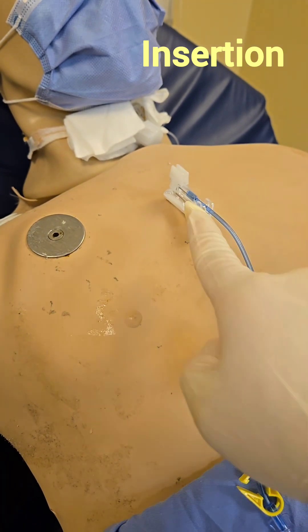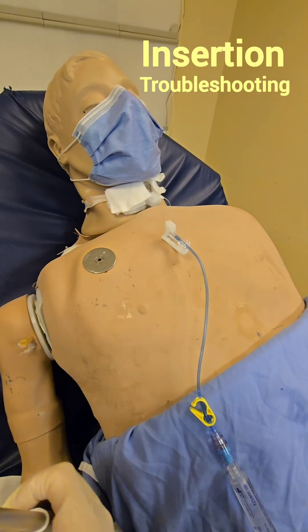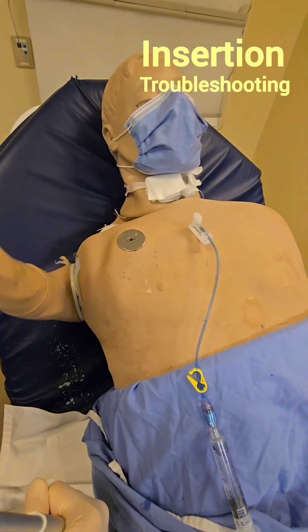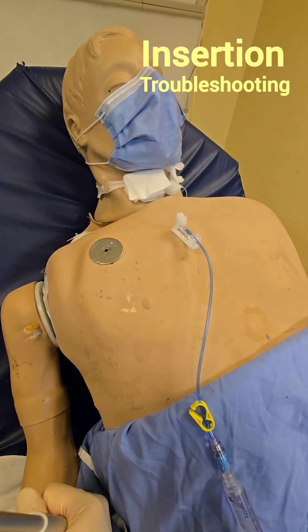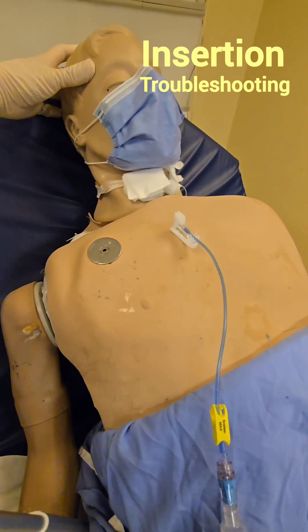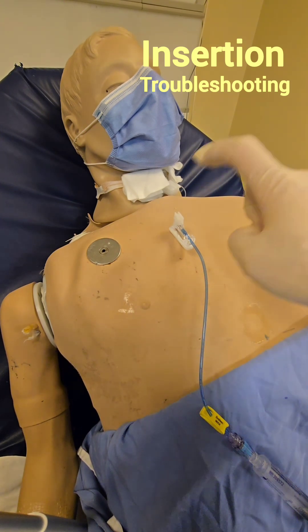Now let's say you inserted the needle and there is no blood return — what do you do? First, ask the patient to raise the arm on whichever side the portacath is in. Then ask the patient to turn their head and cough. Sometimes the line is resting right up against the vessel wall inside. When the patient raises their arm, turns their head, and coughs, gently aspirate and you will very likely get blood return. That's usually what you need to do when there's no blood return on first access.